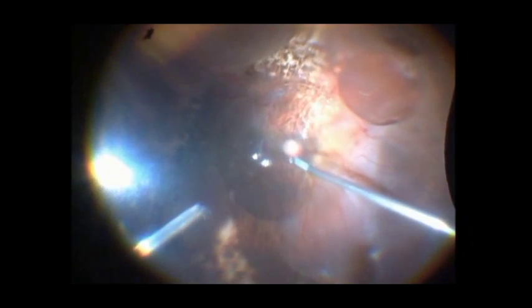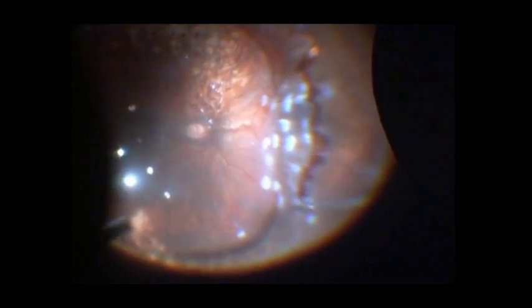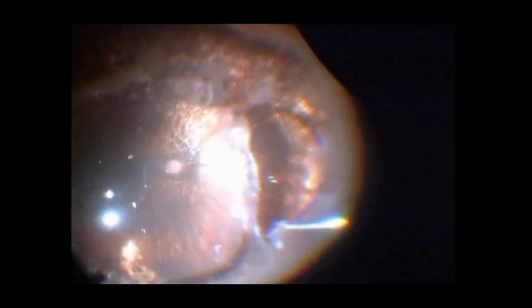This is a case of sub-silicon redetachment with sub-retinal oil. After silicon oil removal, PFCL is injected to flatten the posterior pole and displace the sub-retinal silicon oil to the periphery. Retinectomy is carried out in the areas of contractions. This also results in the release of the trapped sub-retinal oil. Once adequate relaxation is achieved, extensive endo laser barrage is carried out.